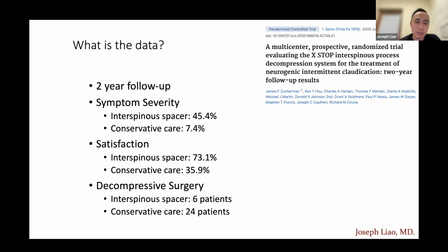From a satisfaction standpoint, 73% of the patients were satisfied with the interspinous spacer and 36% responded well to just conservative care. And for those patients in this study, 6 patients in the interspinous spacer group went on to have decompressive surgery. There were 24 patients from the conservative care arm that went on to get decompressive surgery. So it does show that the interspinous spacer does have some durability.